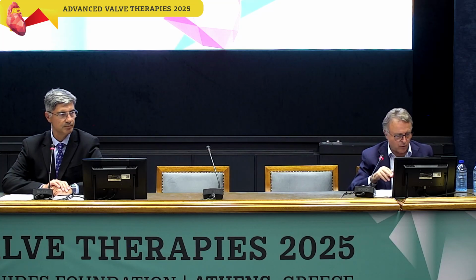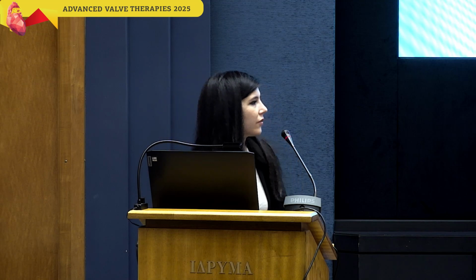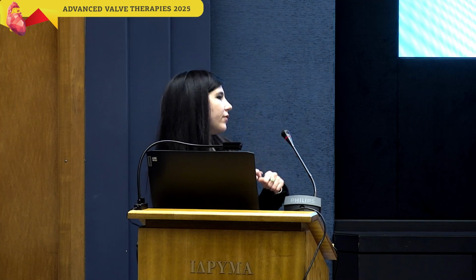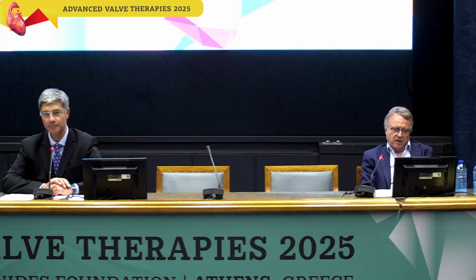Thank you, Dr. Perlepe, for your excellent case. The first question is, do you think that the paravalvular leak is because of the calcification, or the valve was deeper inside the left ventricle? No, I believe that this was because of the calcification, because as you saw, the leak was exactly in the region of the calcification that we saw before TAVI. So I think that this is the reason. So, not because of the position of the valve? No, because of the calcification. Yes, clearly.